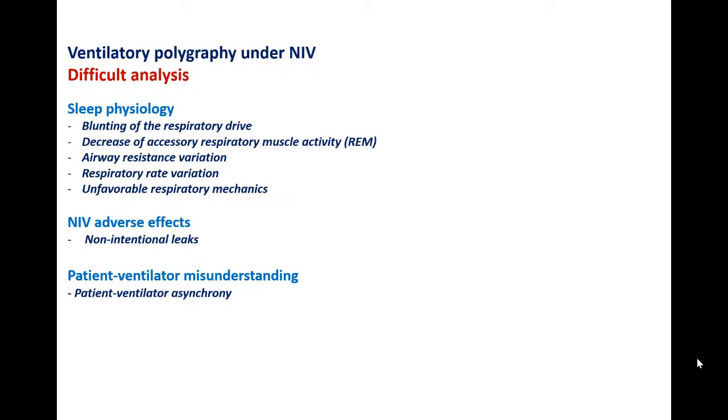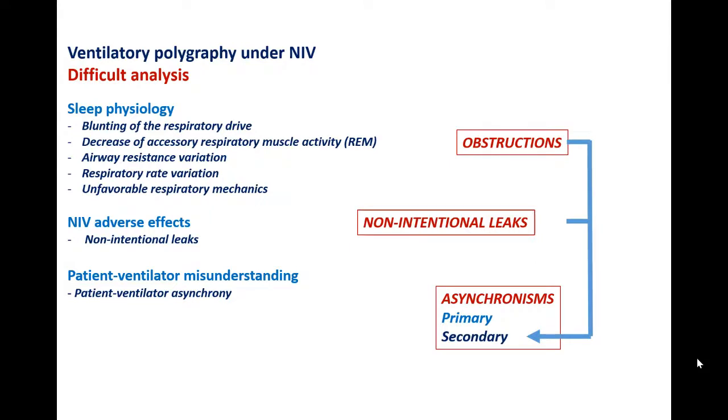Analysis of ventilatory polygraphy under non-invasive ventilation is complex, of course, because many mechanisms interact: sleep physiology, NIV adverse effects, and patient-ventilator asynchrony. Indeed, ventilatory polygraphy is the sum of all those phenomena, which are translated into different events, such as obstruction, non-intentional leaks, and patient-ventilator asynchrony.